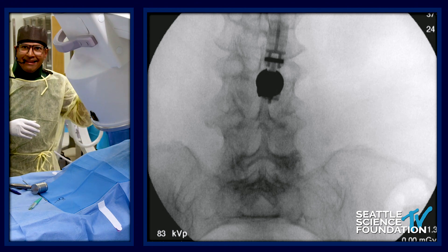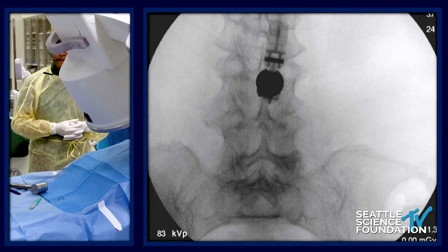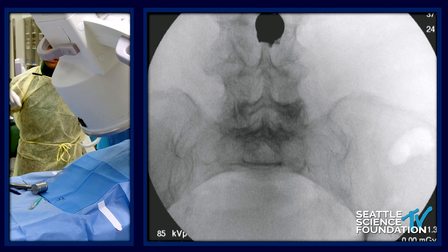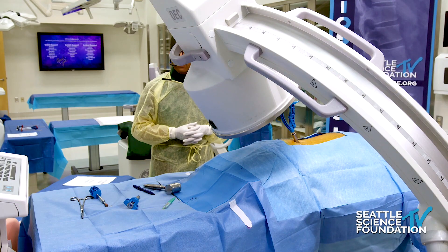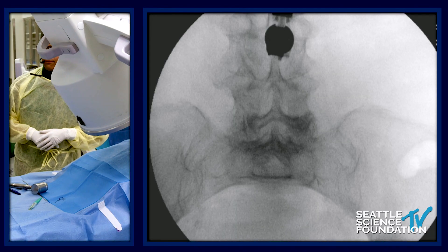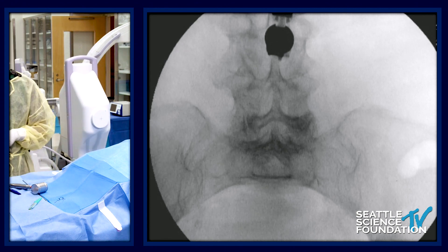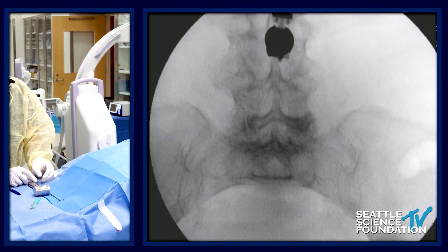That looks great. We can come back around to a lateral. While we get our instrumentation fixed and re-made up, we'll open it up to any questions on the procedure, indications from the study, et cetera.